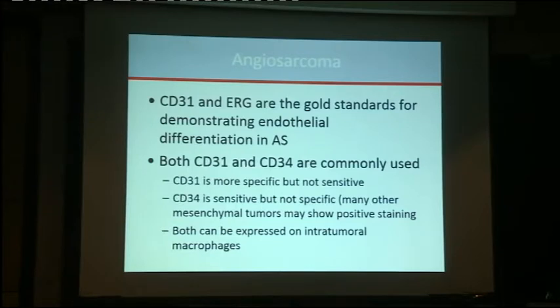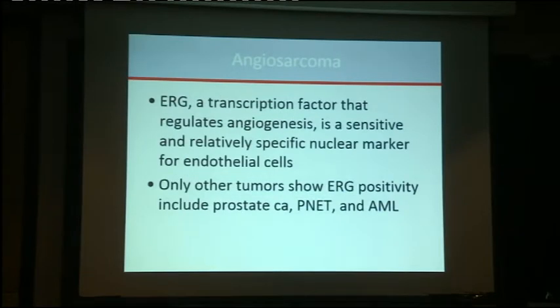Both CD31 and CD34 are commonly used. In general, CD31 is more specific but not sensitive, and CD34 is more sensitive but it is not specific. We have to always remember that both of them can be expressed in the intratumoral macrophages. So especially if you have a small biopsy and somebody is showing a few CD31, CD34 positive cells, you have to be cautious interpreting that.